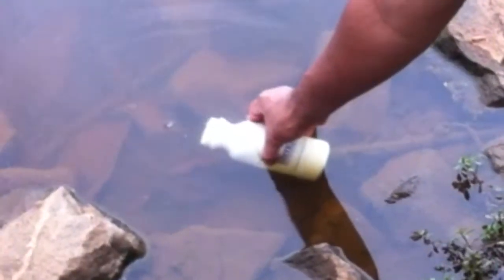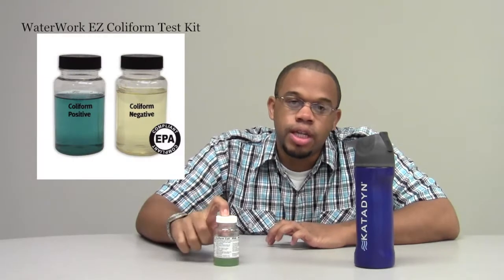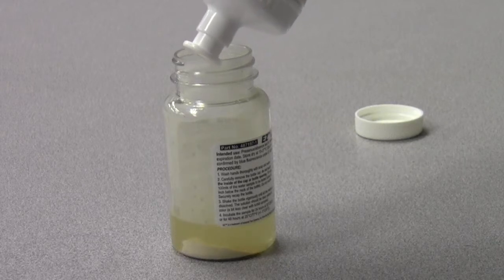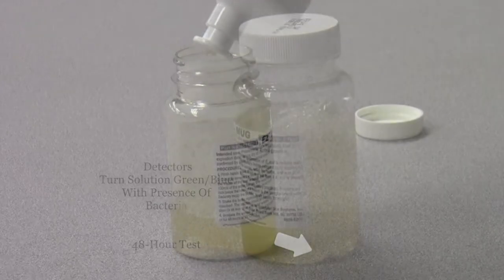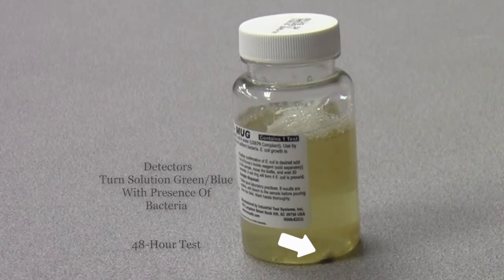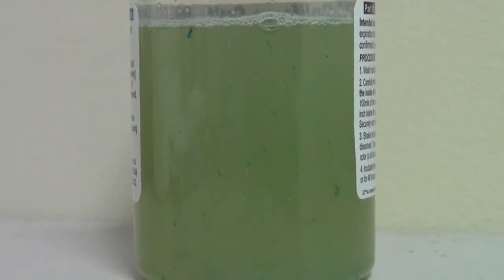We here at filtersfast.com wanted to see if the Cadent bottle water purifier would filter out lake water. To start out this test, I got water from a nearby lake and tested it using the Waterworks Easy Coliform Test Kit. In the end, the results came back that there was a presence of harmful bacteria in the water.